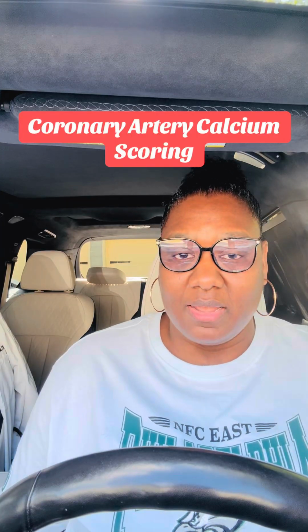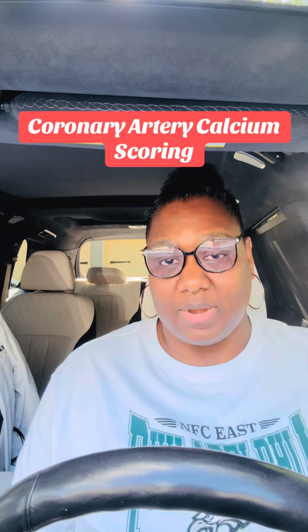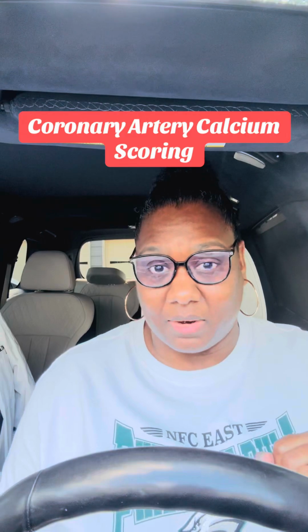The scoring that is calculated, well, before we get into that, to prepare for the coronary artery calcium scoring, your provider is going to prescribe you 2 medications if you don't already have them in your medication arsenal. The first medication is going to be a beta blocker, a cardioselective beta blocker, okay?